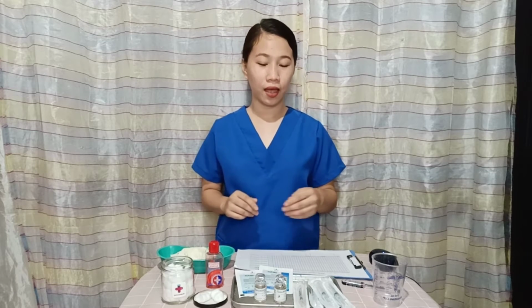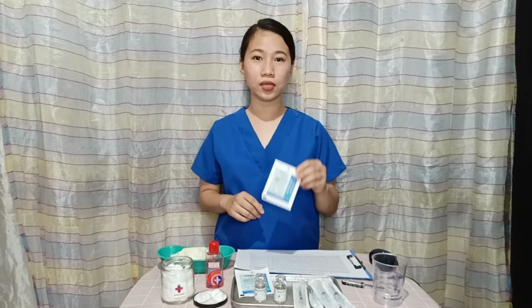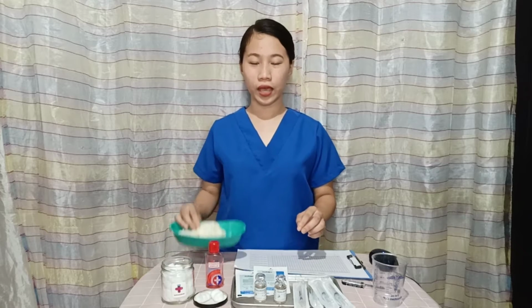For preparation, assess the appearance of the injection site, specific drug action and expected response, and the client's knowledge of the drug action and response. Check the agency protocol about sites to use for skin tests. Next, we need to assemble the equipment and supplies. We need the vial with the correct medication, a sterile syringe, a 25 to 27 gauge needle, alcohol swab or cotton with alcohol, 2x2 sterile gauze, clean gloves, and Band-Aid.